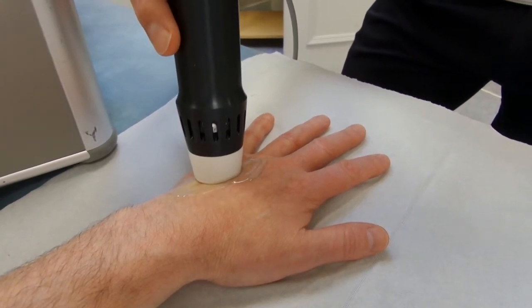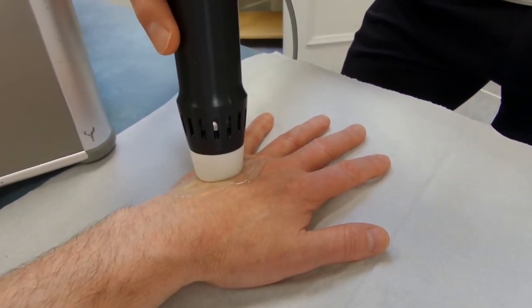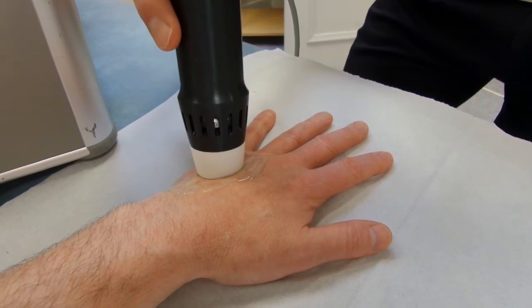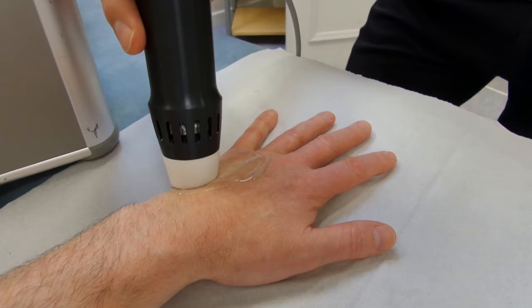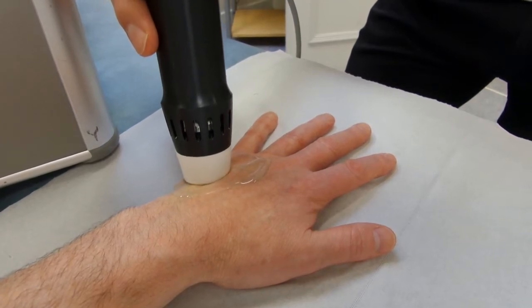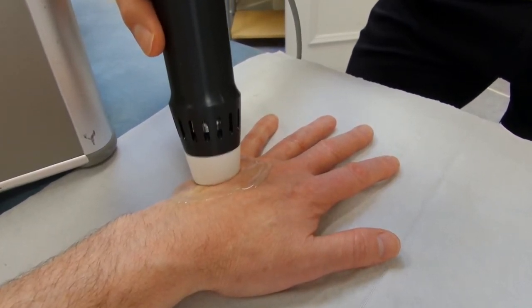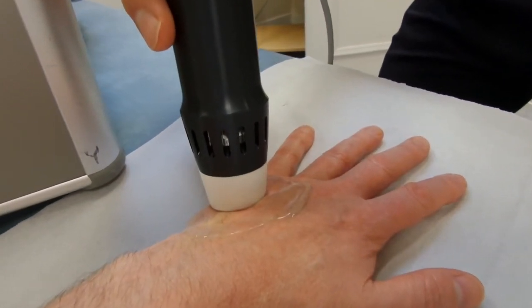Once you find the right area, you want to hold there for usually two to four hundred shocks. Although it doesn't really matter how long you hold for, you do want to hold on the worst areas for a period of time.